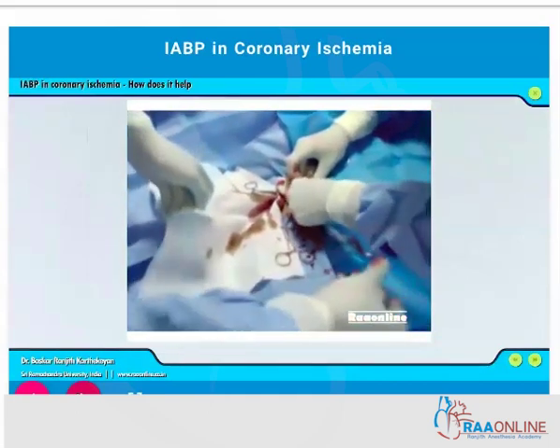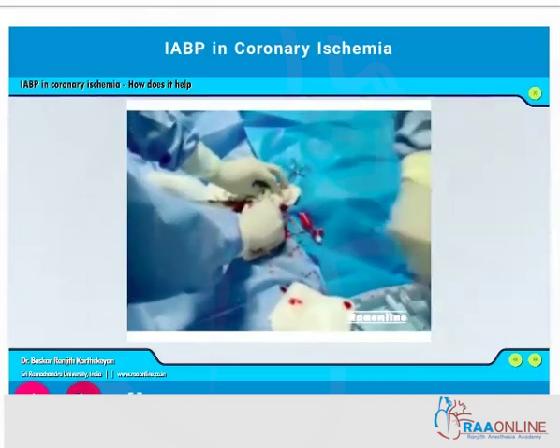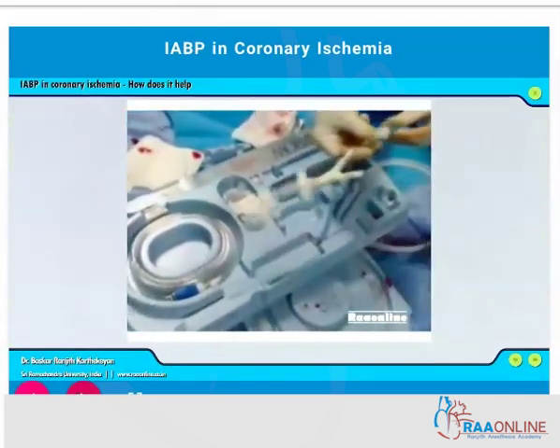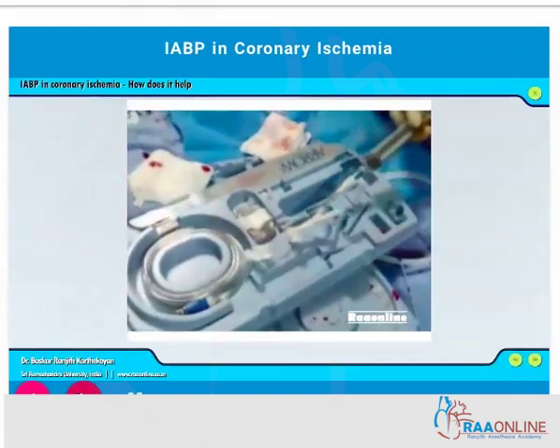Once the tract has been dilated with the different sizes of dilator, the sheath is inserted. Once the sheath has been inserted, the IABP kit is opened and the balloon is completely deflated.